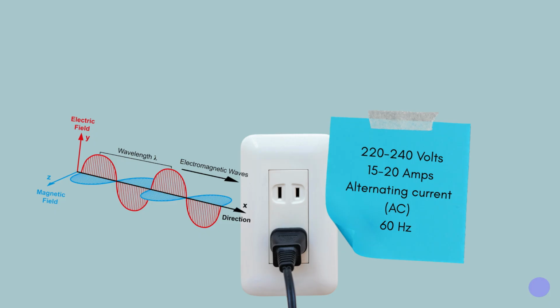Amps are kind of describing our electrons that we're using. You could think of this as the water. So here's your water pressure, and here's your water. You can think of hertz or your frequency here as how fast that water is moving. And then remember, through this outlet, we get alternating current. So it looks like this. This is the sine wave, the waves that we have been seeing for electromagnetic energy.